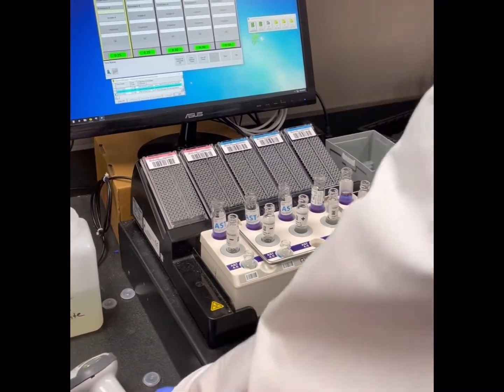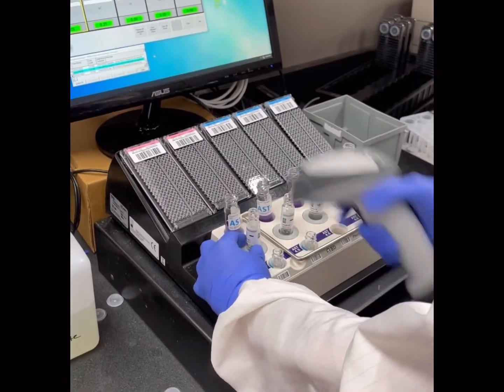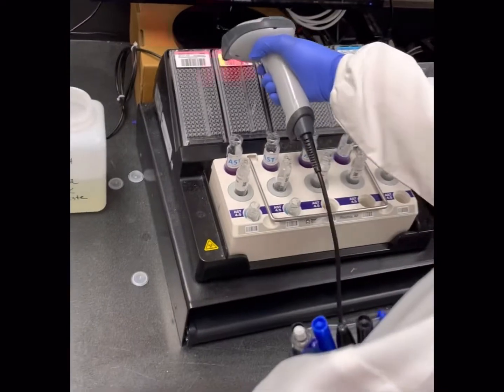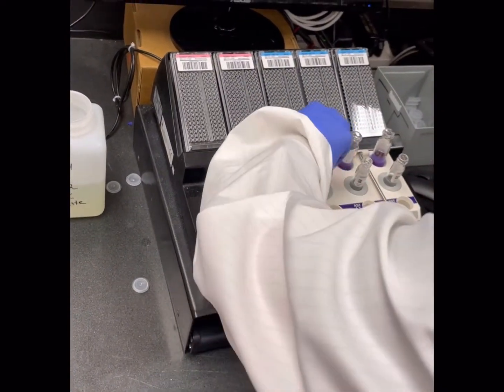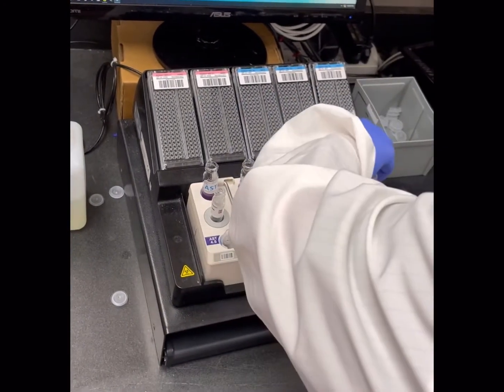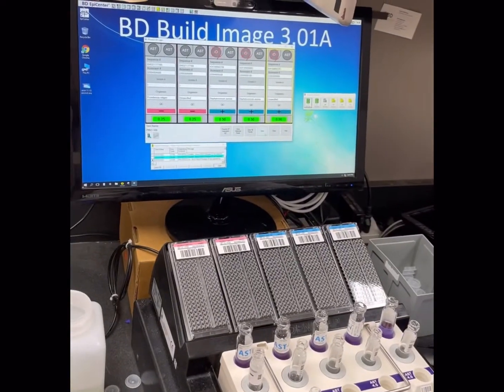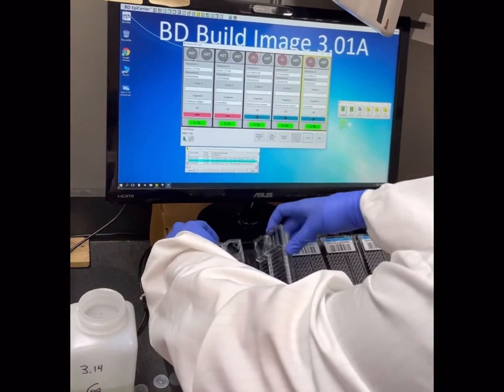Begin scanning from the bottom up, starting with the barcode on the rack, indicating the position of the tube. Then scan the code on the ID broth tube, followed by the barcode on the panel. Once all of the tubes in the rack have been scanned, click Save on the login screen and turn over all of the panels.